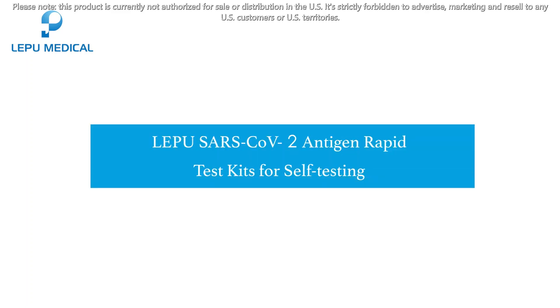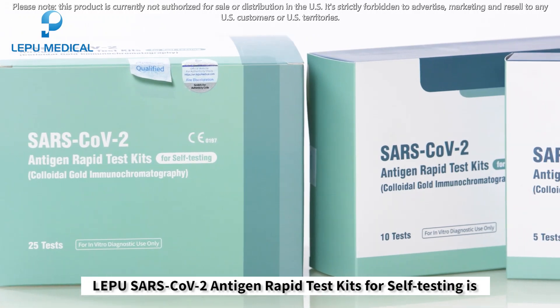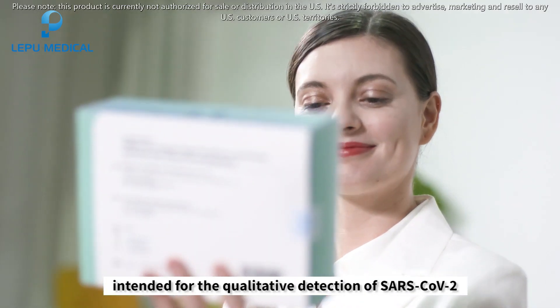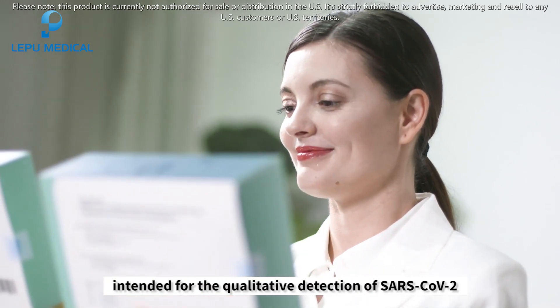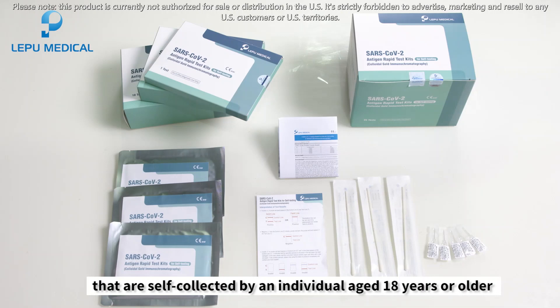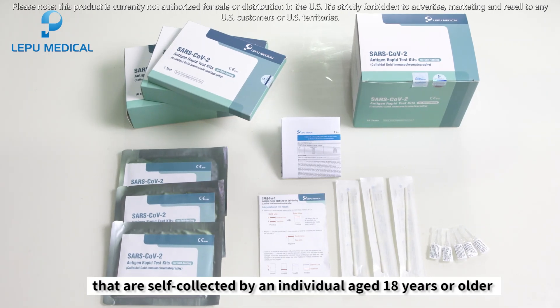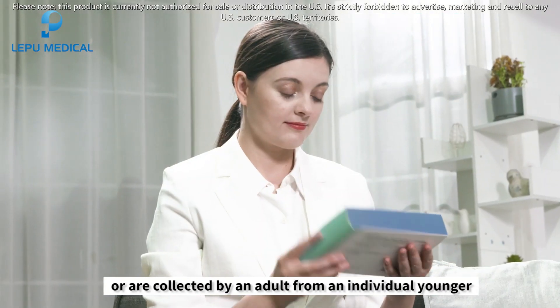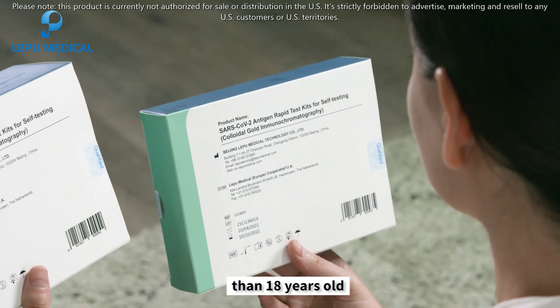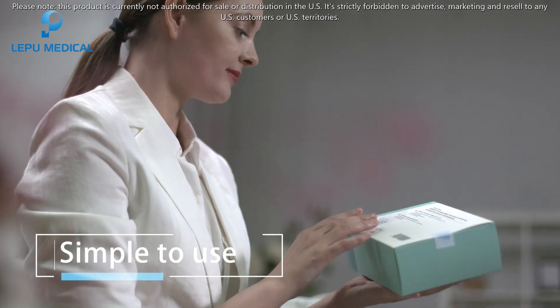The Lepu SARS-CoV-2 Antigen Rapid Test Kit for Self-Testing is intended for the qualitative detection of SARS-CoV-2 nucleocapsid antigens from anterior nasal swabs. These swabs are self-collected by individuals aged 18 years or older, or collected by an adult from an individual younger than 18 years old.